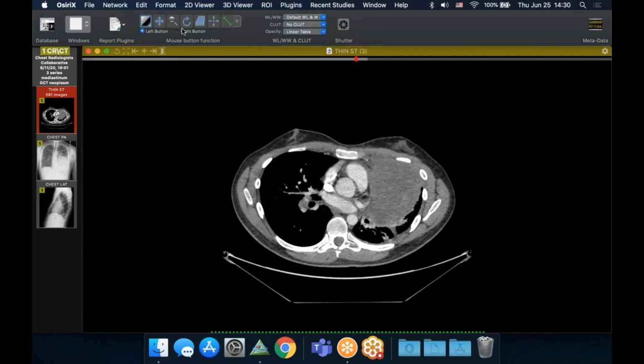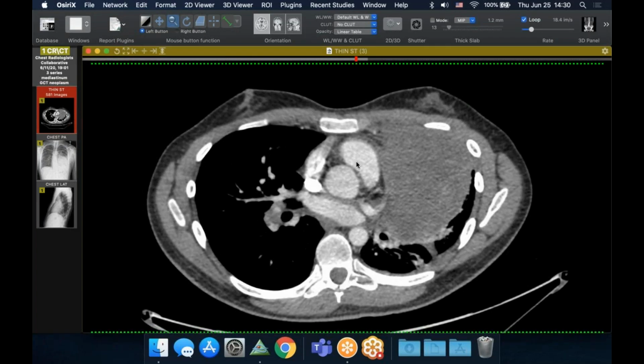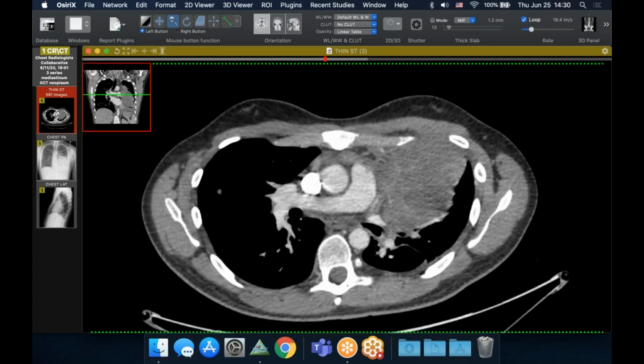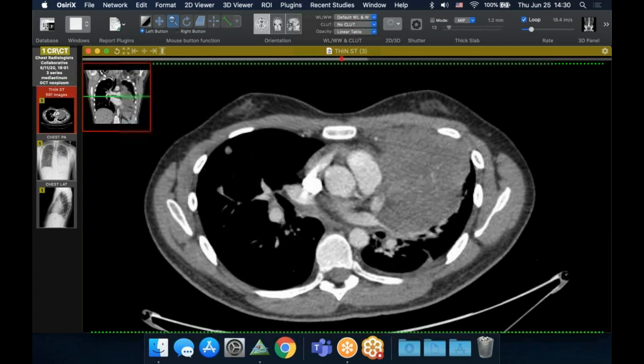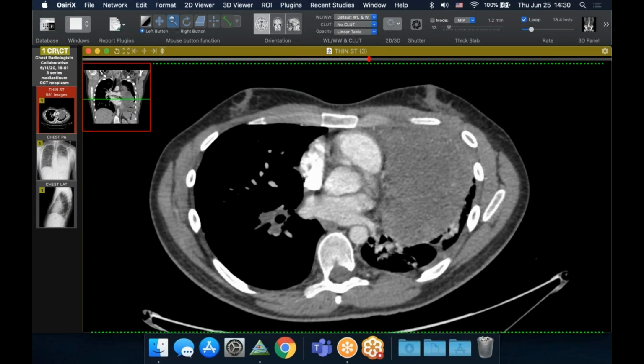And the history is he has a history of Klinefelter syndrome, and that's the XXY sex chromosome abnormality. So they're phenotypically male primarily, but something like 20% of malignant germ cell tumors occur in this population. And this is one of these big, ugly, malignant germ cell tumors with a primary prevascular, big, hard to see where, mediastinal mass. And this one has metastasized to the lung.